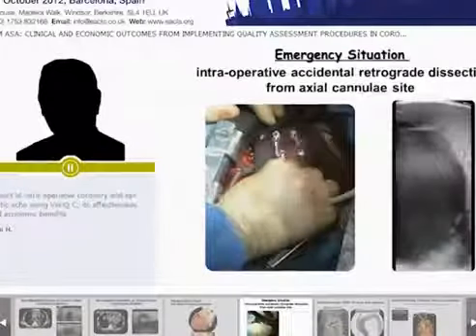Because there's a very limited landing zone for this part, we put a stent here and we put another debranching graft over there. And after we positioned the stent graft, the angiogram did not show the patency of the radial artery graft. So I wondered whether I should revise the radial artery or not.